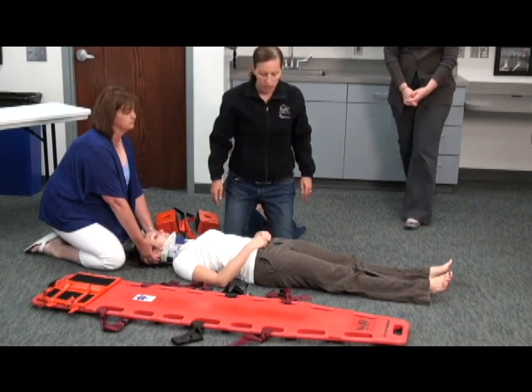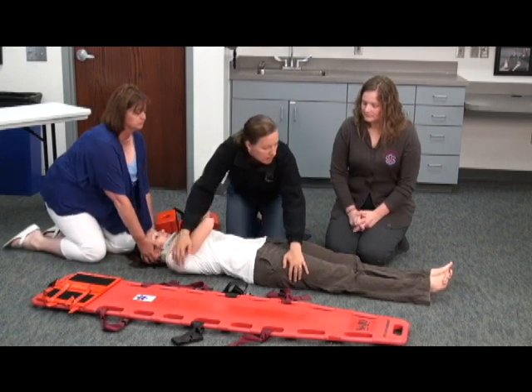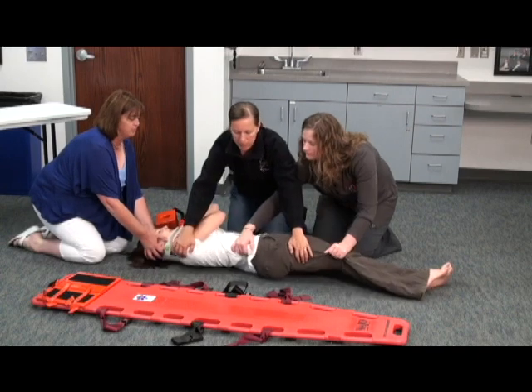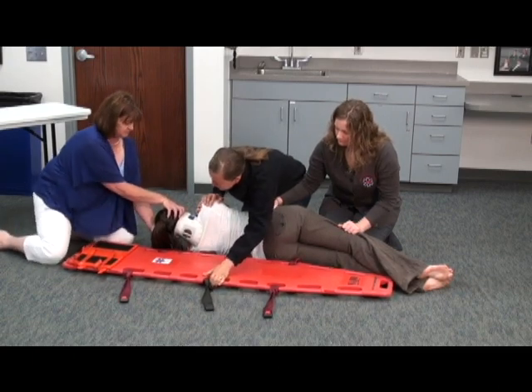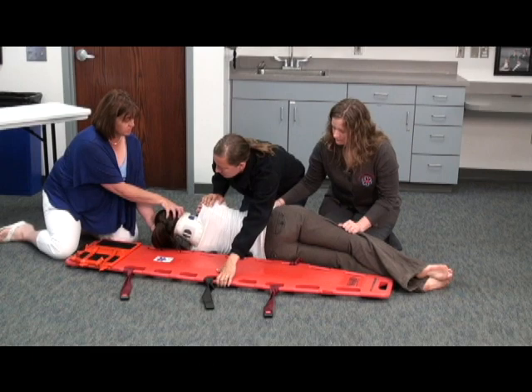If you'd come down and help me roll — I'm going to have you put your hands across your chest and we'll crisscross arms. And on her count of three, we'll roll. One, two, three.